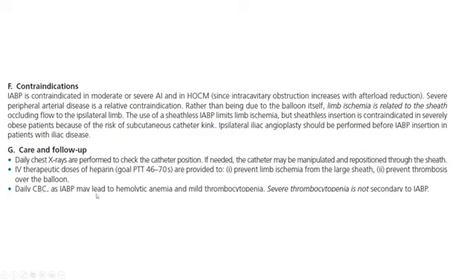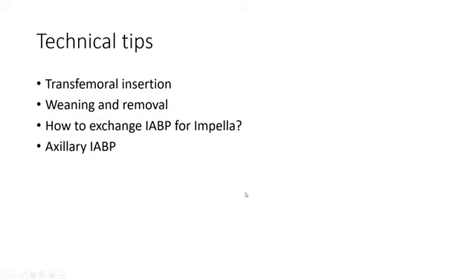You need to get daily CBC. Balloon pump may lead to hemolytic anemia, a lot less than Impella. It's usually not a major problem with balloon pump. It's actually a rarely significant problem. It can cause mild thrombocytopenia. If you have severe thrombocytopenia, less than 50,000, it is not usually due to balloon pump. You should think of something else, HIT or medication induced or other reasons, but it's usually not your balloon pump. Okay.